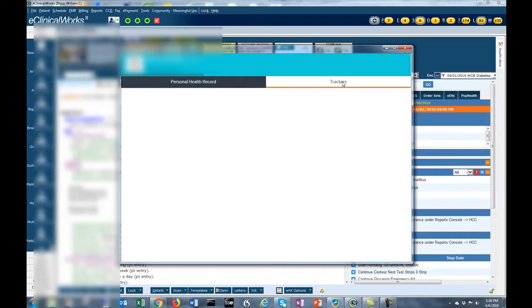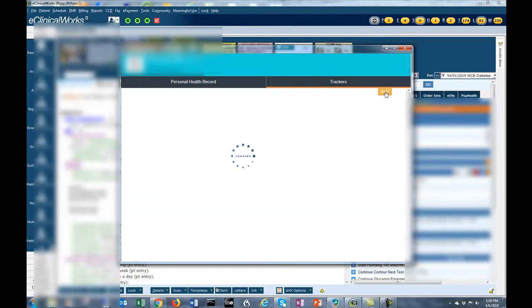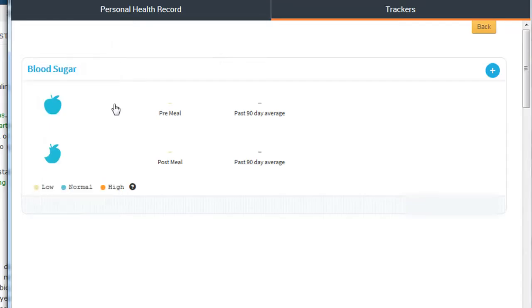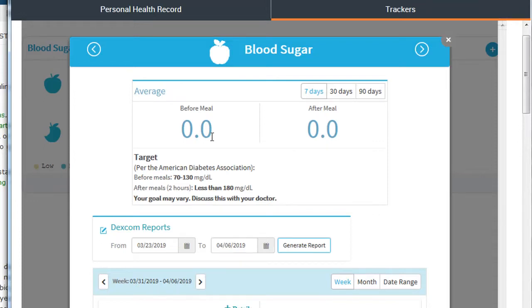Once you've clicked up the Helo hub, choose the trackers header. Then find the orange button that says Tracker Details. Click on that. You should see a blood sugar box. Click inside of the blood sugar box and it will come up with these reports.